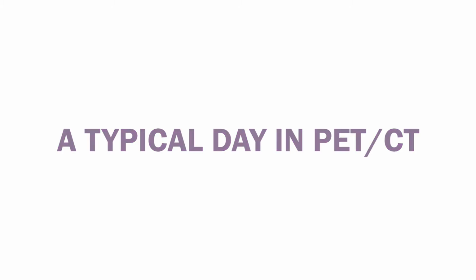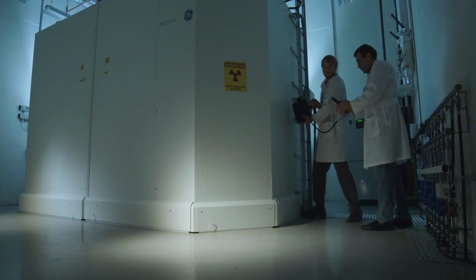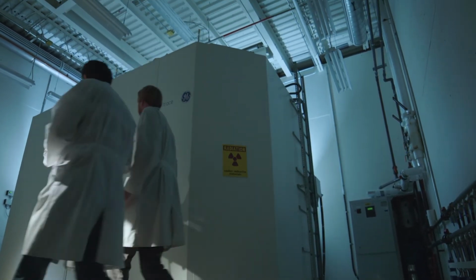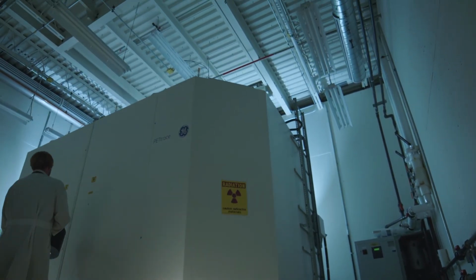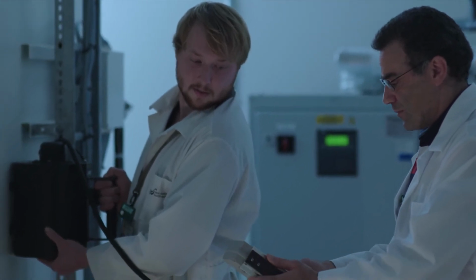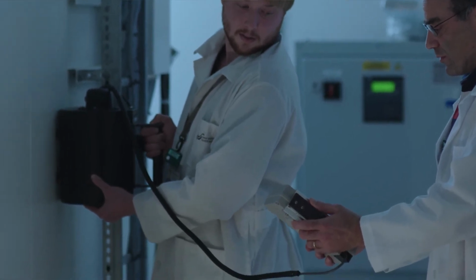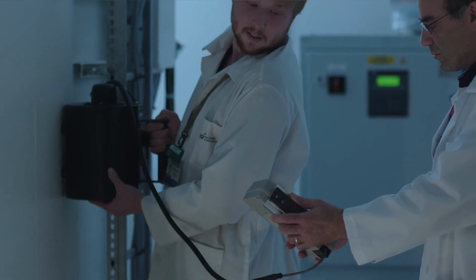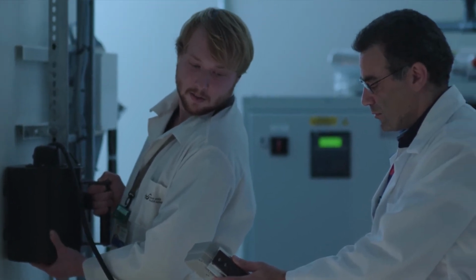So first of all, you have to make the sugar. And so the folks at the cyclotron arrive pretty early in the morning. They set up the cyclotron for production. In order to make those radioactive atoms that get incorporated into our sugar, they have to fire a high energy beam of particles at a little target, and that produces our fluorine. That gets run through a chemical process to actually put it into the sugar.